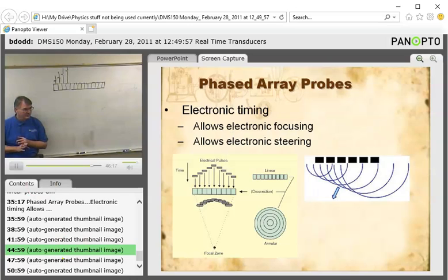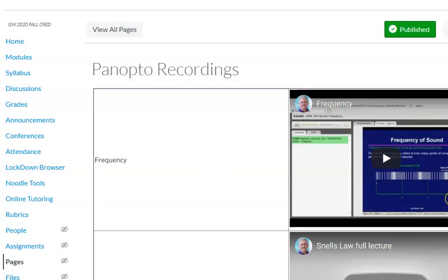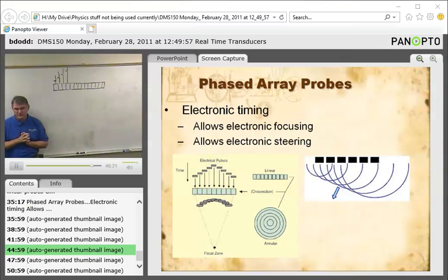That was, we've got about halfway through chapter 8. That's some heavy stuff in there. So we're going to go over that again tomorrow. We're going to talk about phased array scanning, not just to make sector images, but as you guys were alluding to, steering for your Doppler, and as this shows, we can actually focus it using the electronic pulses.